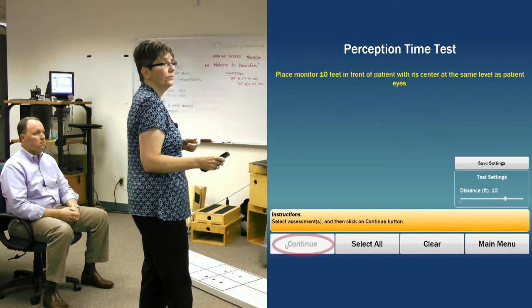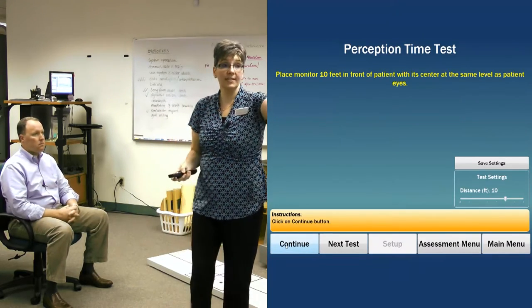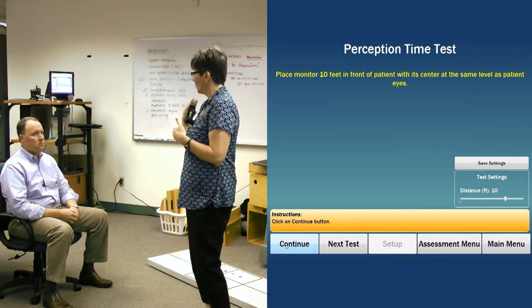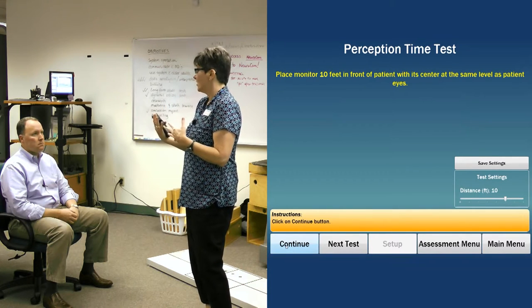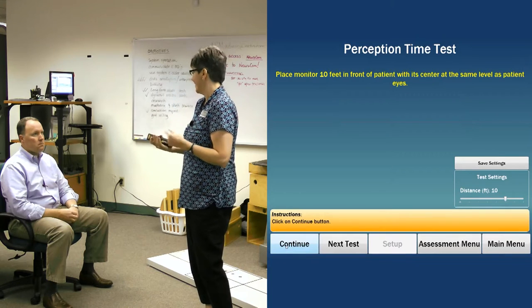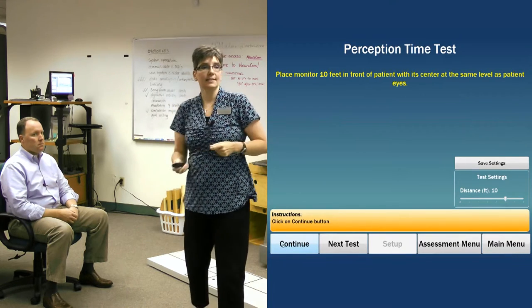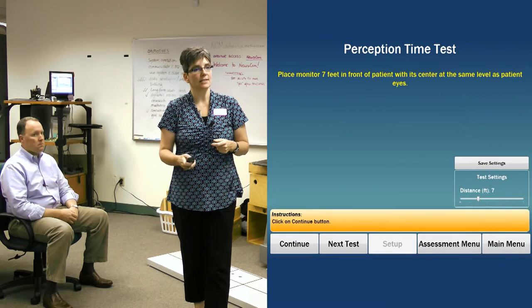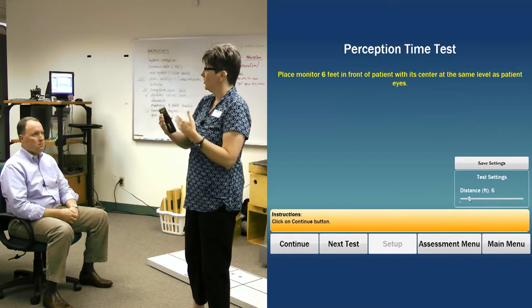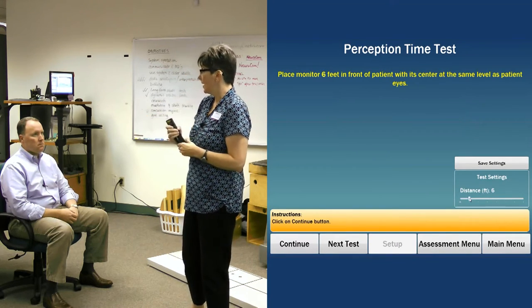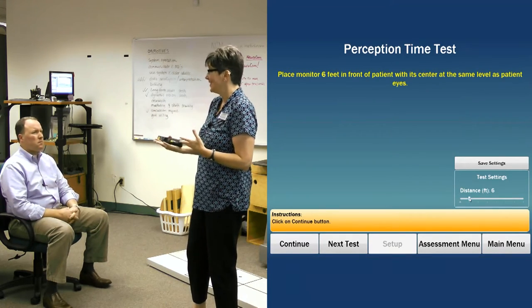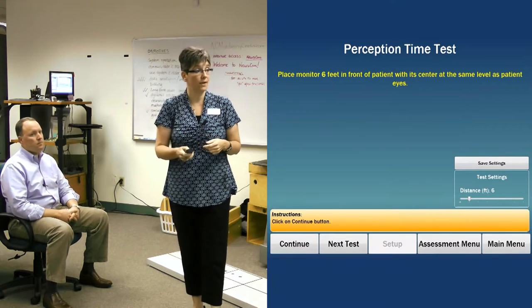I'm going to click on continue. You'll notice that I can choose the test distance — how far away is the patient from the screen? The computer needs to know this because it adjusts the size of the optotype based on the distance. The distance right now is 6 feet. The minimum distance is 5 feet and you can go as far as 12 feet. A lot of clinics have space constraints, so you can have the patient sit as close as 5 feet away from the screen.